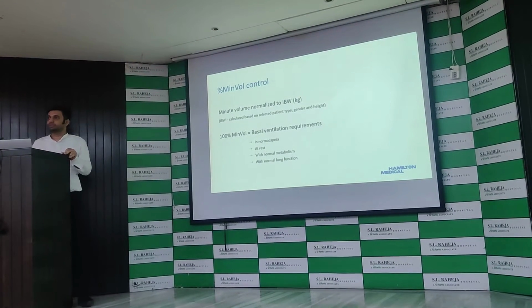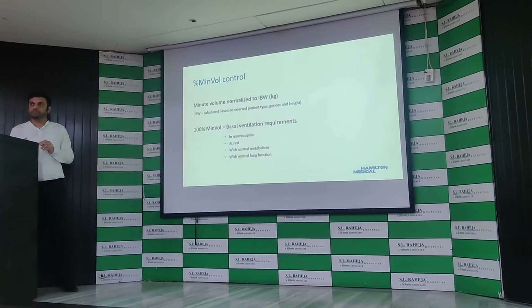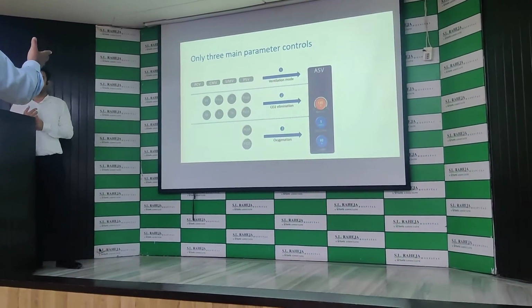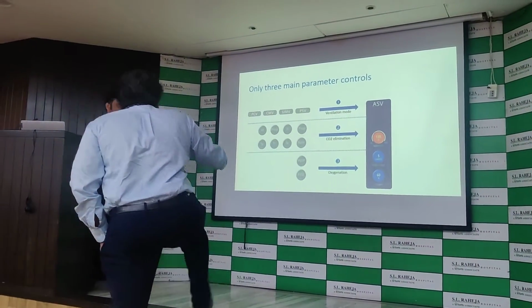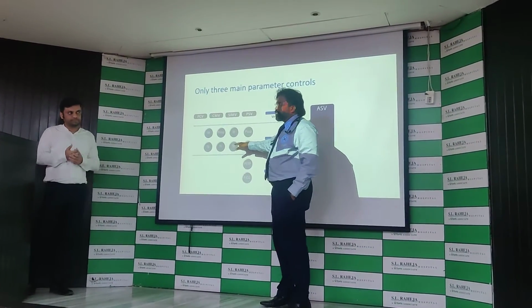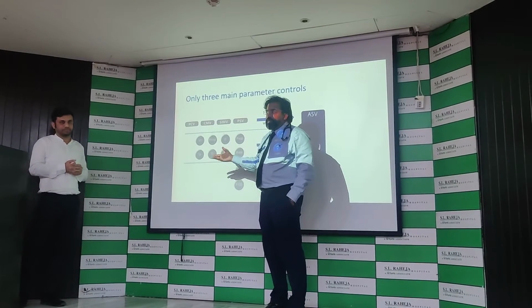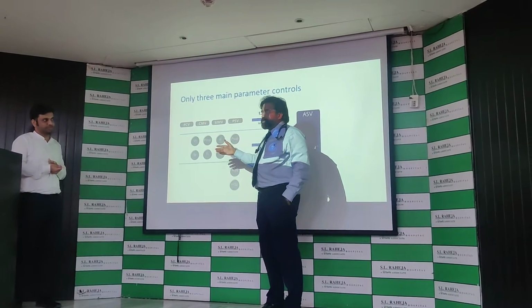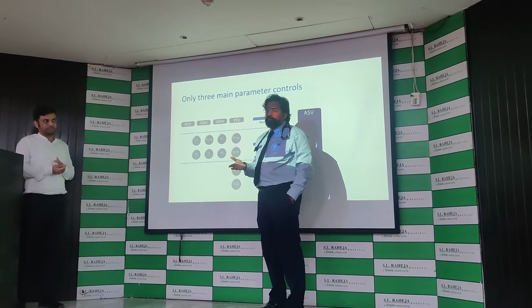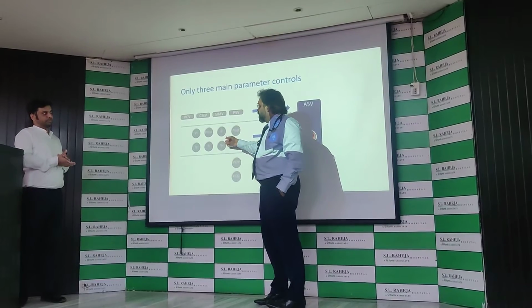Moreover, in the conventional mode, you may need to set this 3 times in the day. Importantly, if your patient goes from low compliance to high compliance and back to low compliance, I need to set this again. I see my plateau pressures, I need to set it again. I see my peak pressures, I need to set it again. I need to do it at least 3 to 4 times in the day. Our patient does not stand straight, it actually moves. That is why I need to set it again and again.